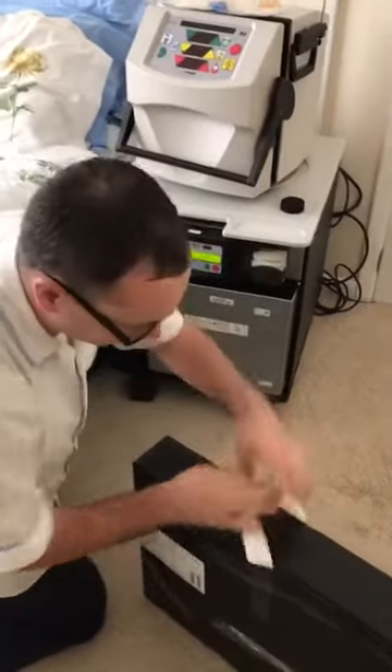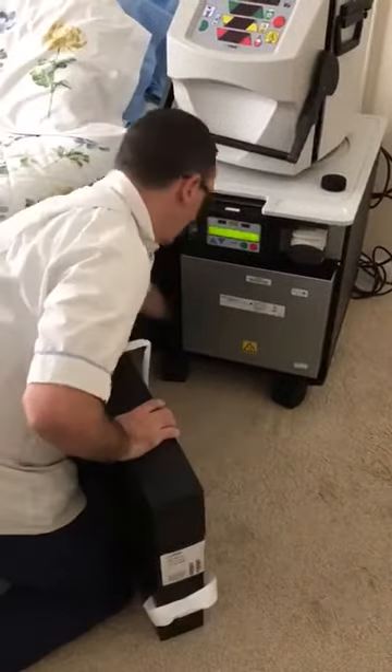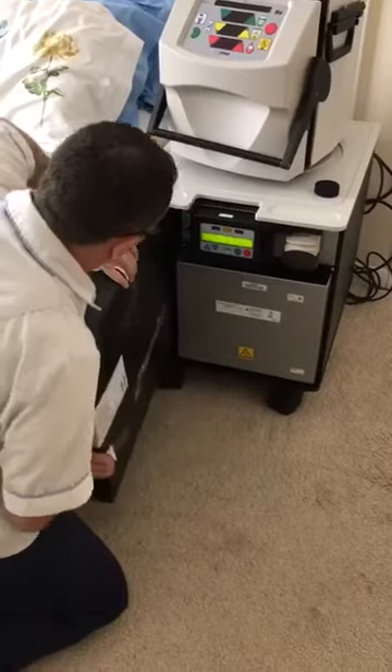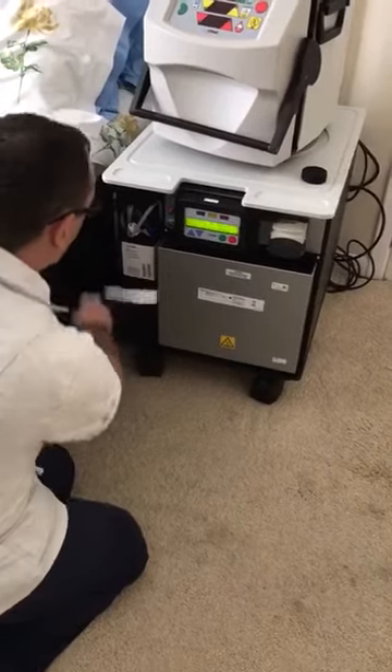First thing we're going to do is open the door and slide the pack in, making sure that the base is nice and dry and that the leak detector is dry. Slide it in and take the front cover off, then slide it all the way back.